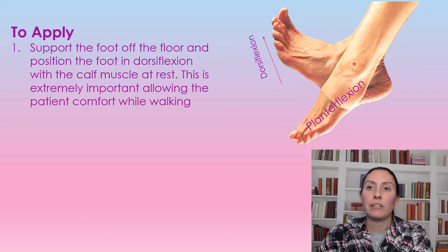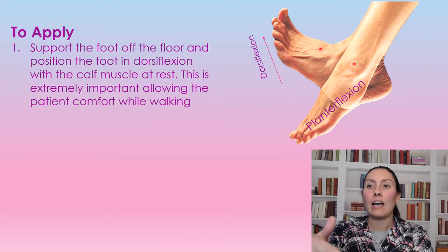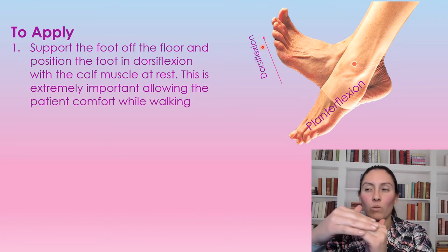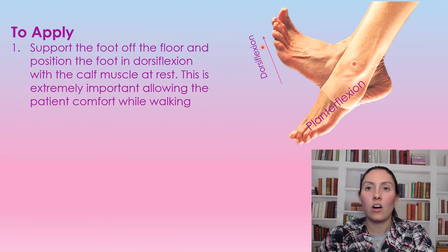When you go to wrap the leg, one of the most important steps is making sure the foot is in a dorsiflexed position. As you can see here, the foot is pulled up but the calf muscle is at rest. This dorsiflexion allows the patient to walk comfortably and prevents wearing at the crease where they walk, because that can cause a wound.